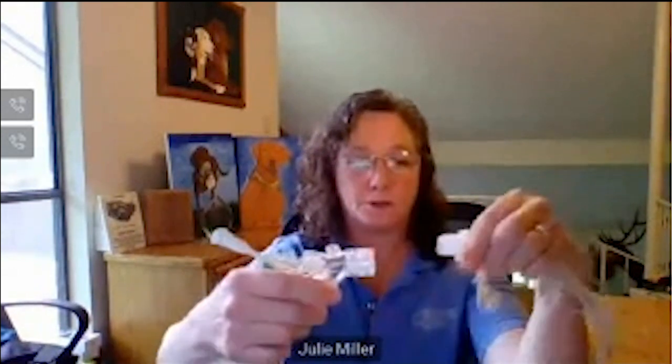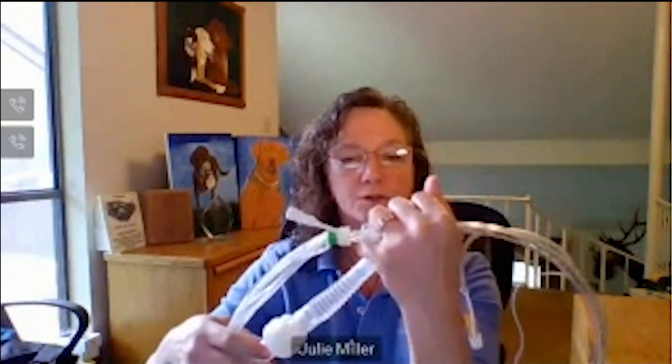Here's the endotracheal tube connected to the ventilator, and the inline suction is right here. Take your thumb and index finger and put them around the endotracheal tube below where it's connected to the machine. Take your next three fingers and grab the intersection of the endotracheal tube to the machine, then put your little finger in the Y. That gives you a good, stable grasp on the tube so you can suction without accidentally extubating the patient.